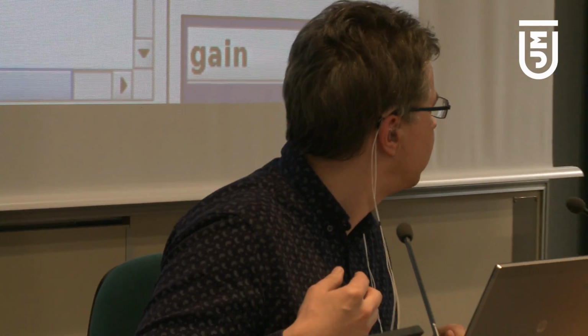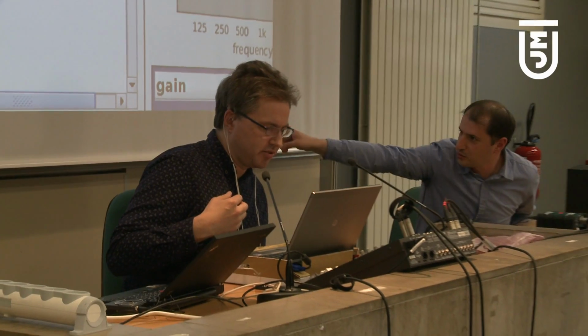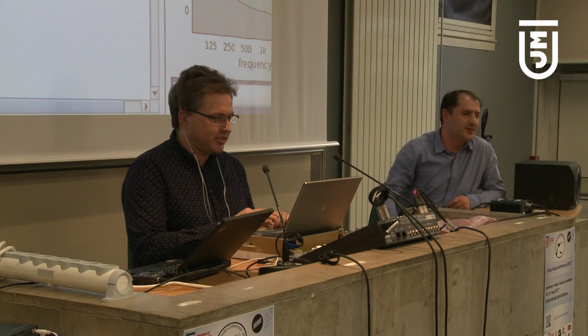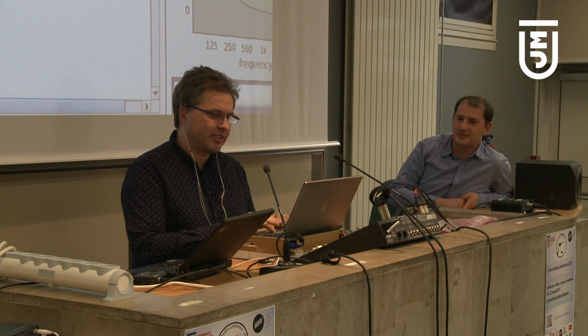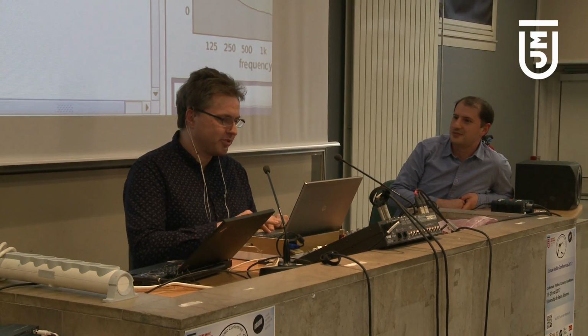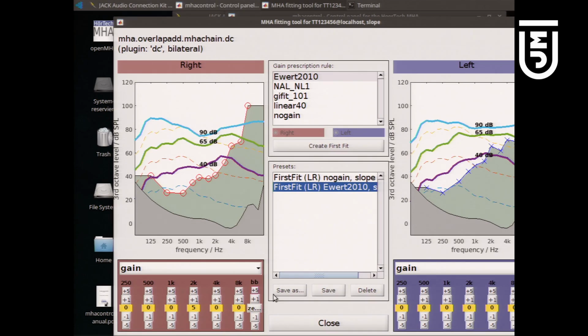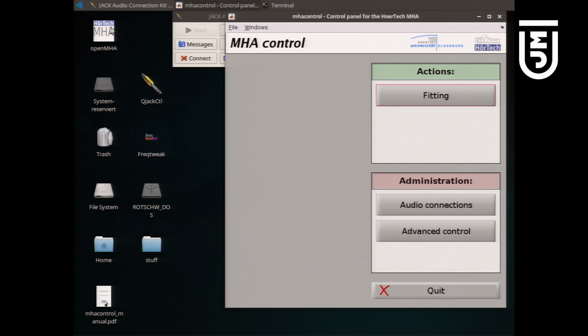And I can now make it a little bit softer or louder again. Can you show the gain? The gain adjustment is visible here. Okay. I'm sorry. Yes, but actually I can't do anything. Just be informed, here in the lower part of the screen that you can't see now, there are some buttons that say +5, -5, +1, -1 dB in certain frequency bands and also broadband. Okay. Now I close this, and you want to see the spectrograms.